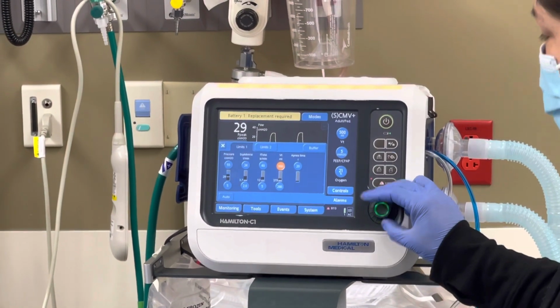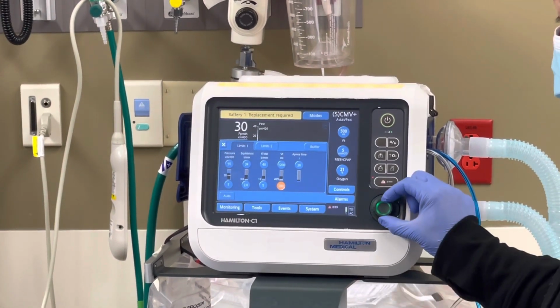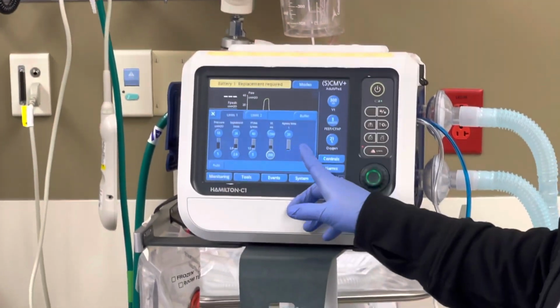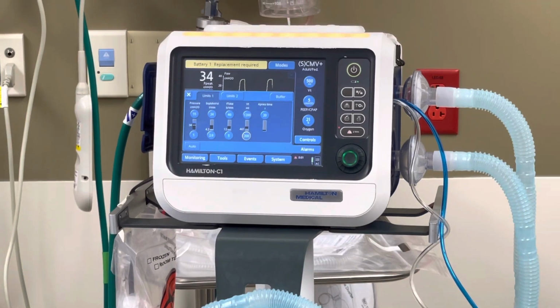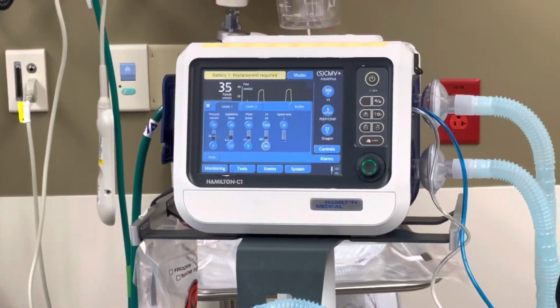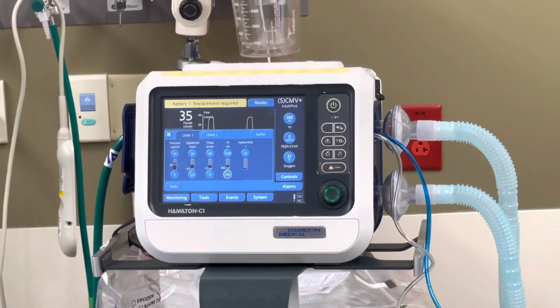My tidal volume, if I'm set to 500, I'm gonna go to about 1200. And I'm gonna do 200, because anything below 200, I really wanna know. And I keep my apnea setting at 20. These are like my starting points. After I get a few breaths from my patients, then I will adjust my alarms appropriate for that patient.